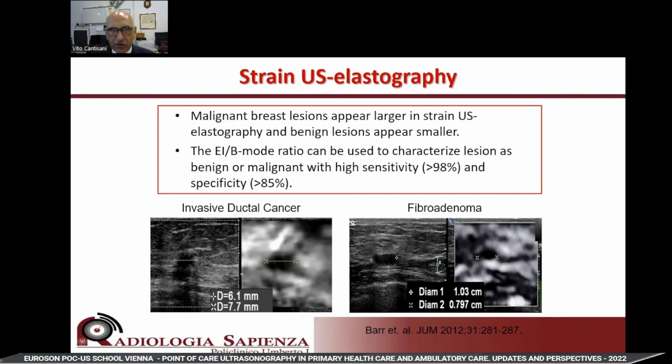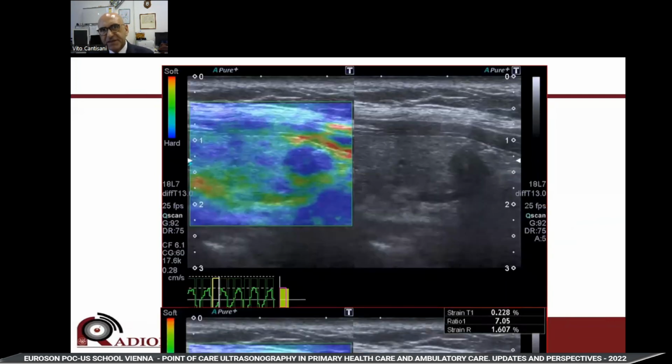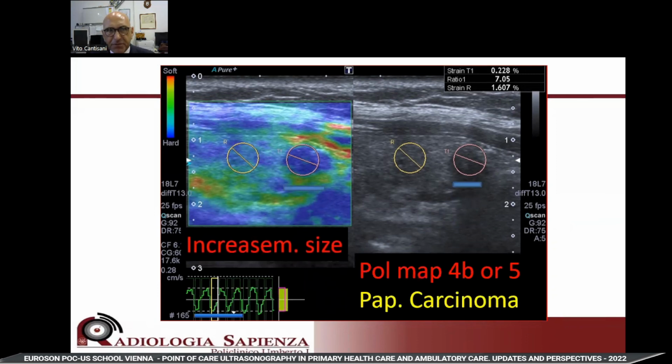It is more evident for breast, and I thank Richard Barr for his contribution to my lecture and for this very nice slide, and also for his experienced and very nicely reported paper that showed us the evidence. However, I had the same impression also for thyroid, and there is evidence that for thyroid it also works as a possible worrisome sign.